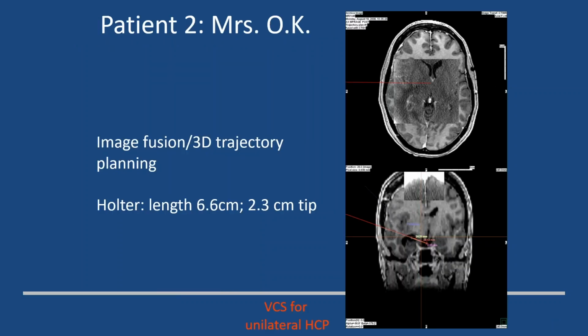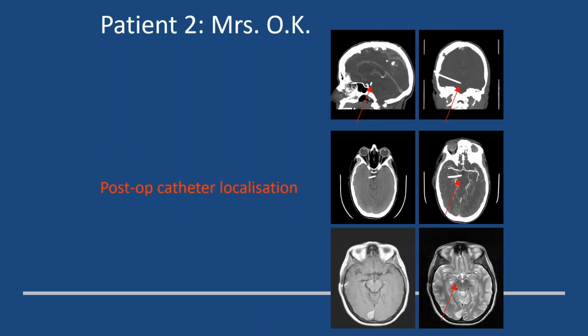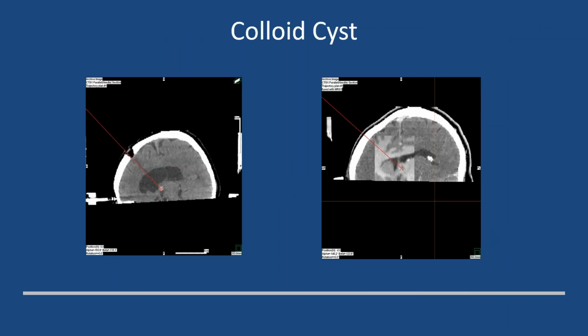This is just another case showing you the technique of a trapped ventricle drained into the prepontine cistern. In this case, that's why I'm showing it, we also did an intraop CT angio, which you can do with the BodyTome, to show that we didn't cause any vascular compromise either.